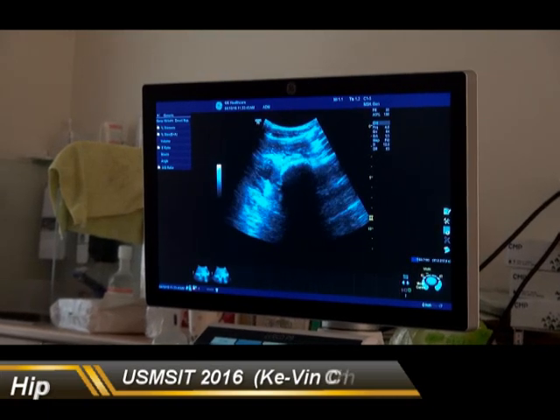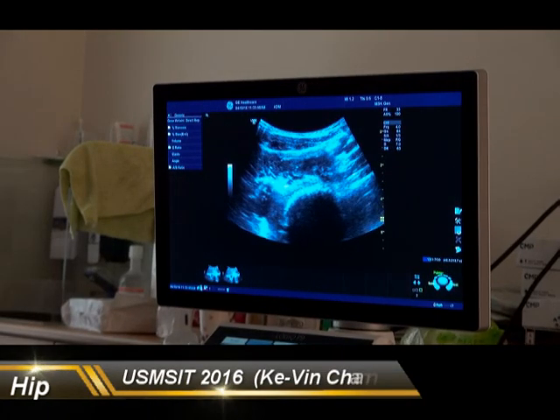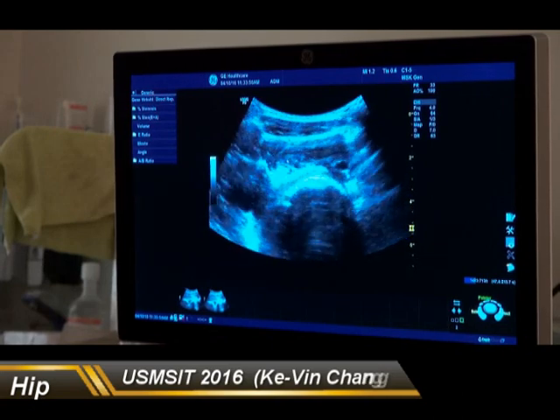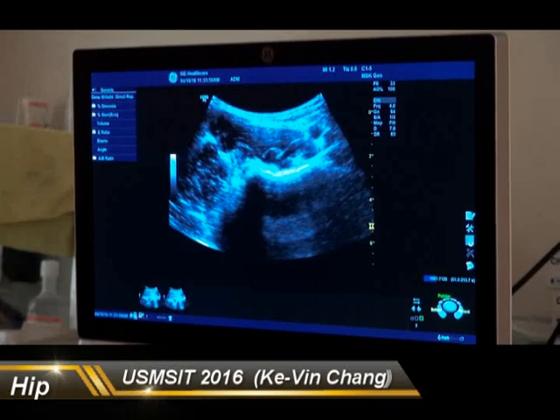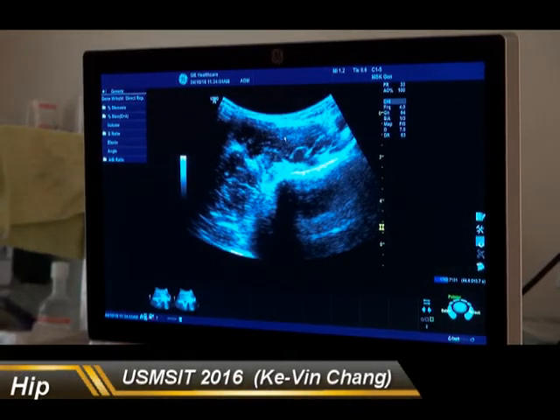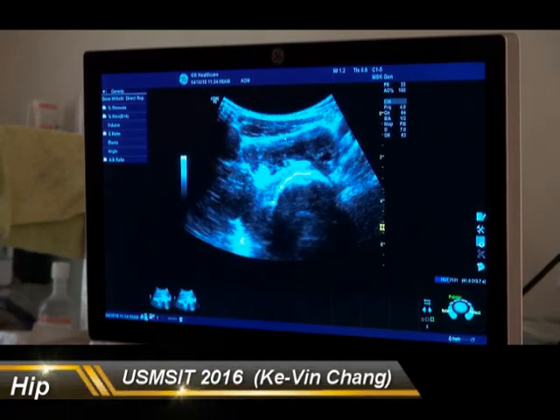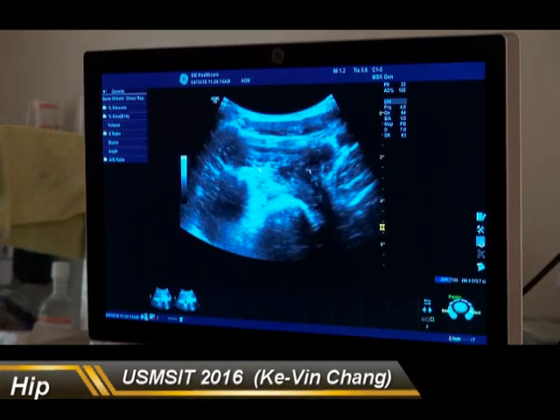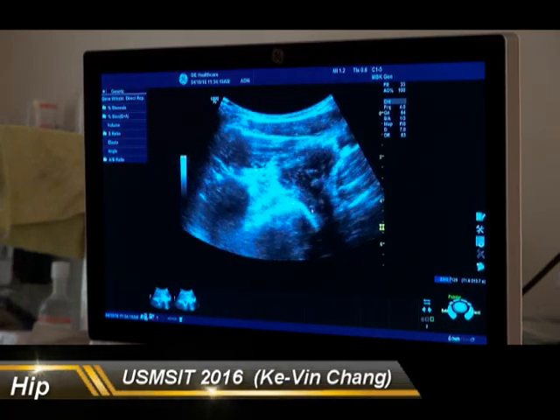In this view, where is the sartorius? Sartorius is over here. The one below is the iliopsoas muscle. If you move your probe more medially, you are going to see the iliopsoas muscle can be divided into iliopsoas components. When we move our probe more distally, you are going to see the tendon of the iliopsoas muscle, and then it will insert on the lesser trochanter.